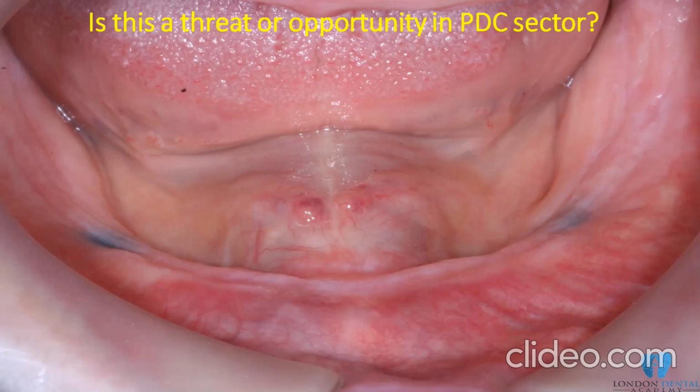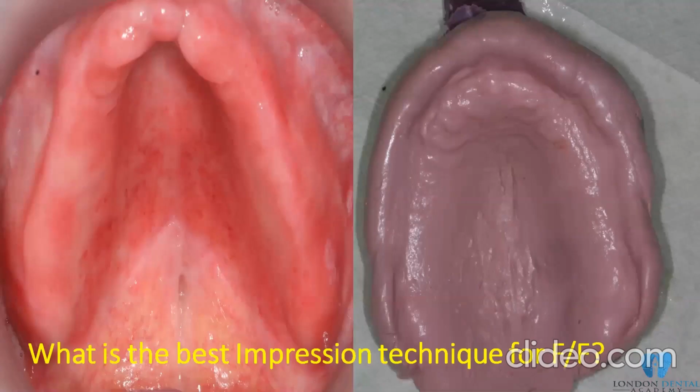So we don't need a very, very flowable material like a light body silicone, for example, or medium body silicone, because that will flow straight away and will give you good extension, but will not give you good width in this region. And borders and border molding is about width rather than extension. I think that could be explained in different sessions, but let's just crack on with more cases.